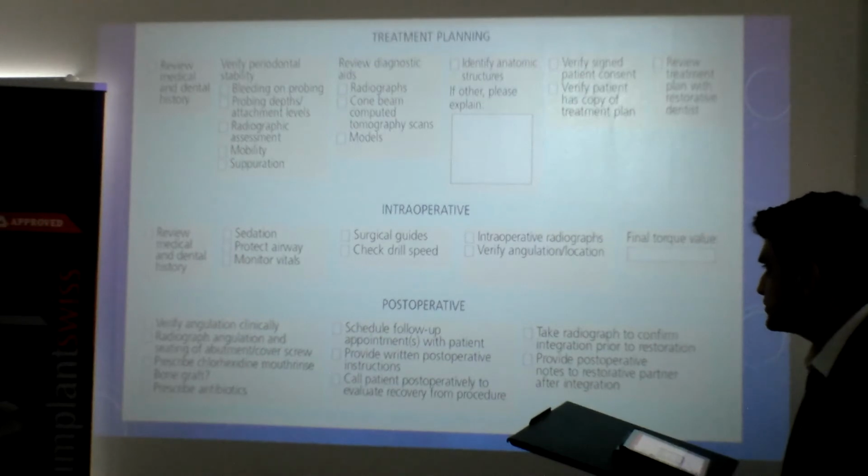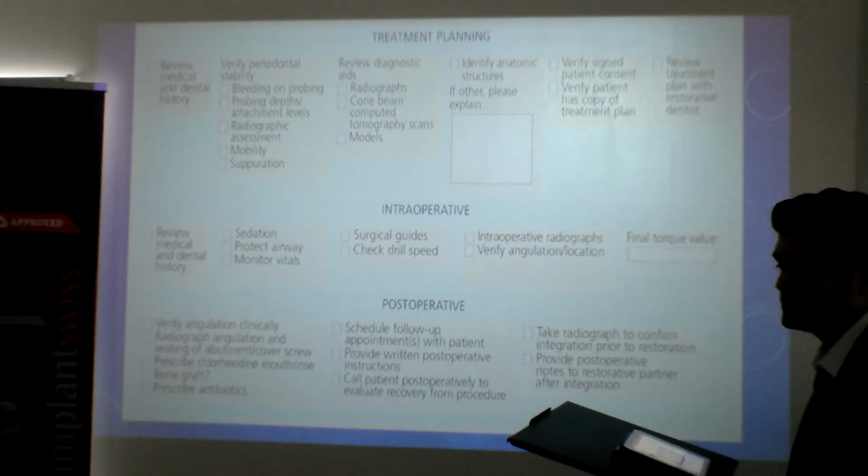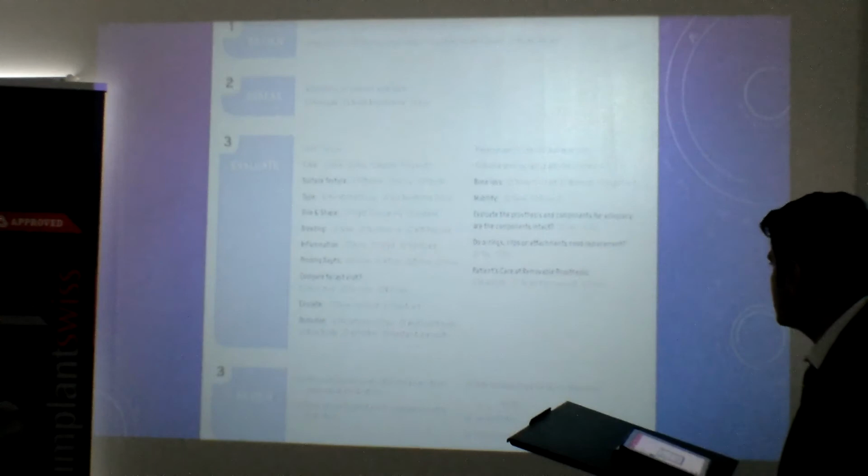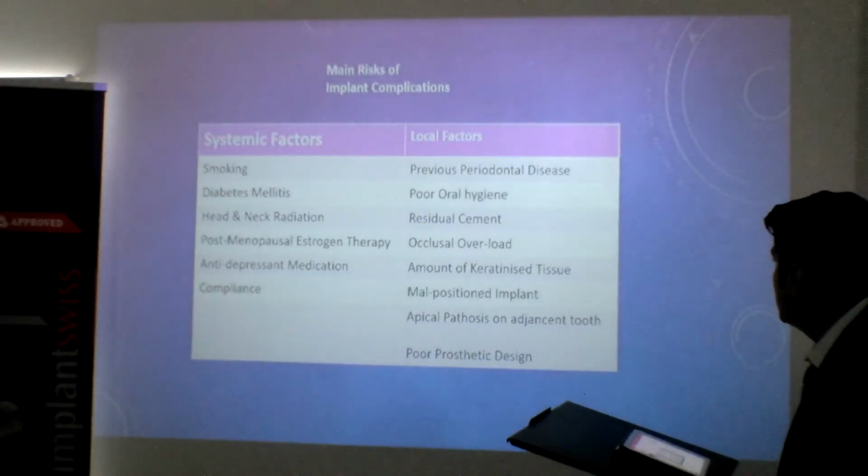Direction indicators, never ever forget them. Angulation must be constantly kept in mind, because that's where your eventual restoration will lie. So keep on checking, keep on checking. Rest is, of course, the template we leave it for now.